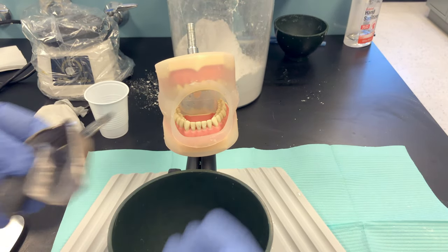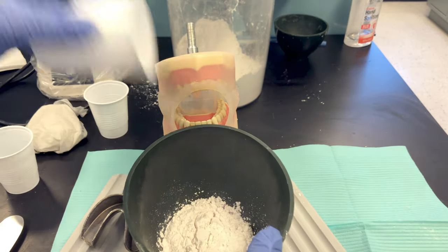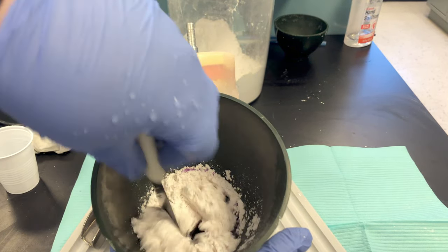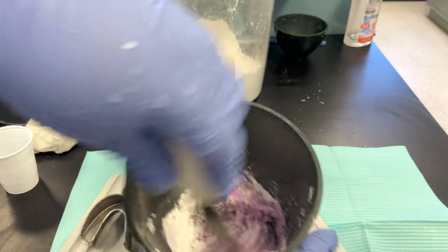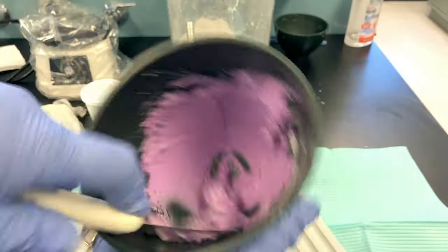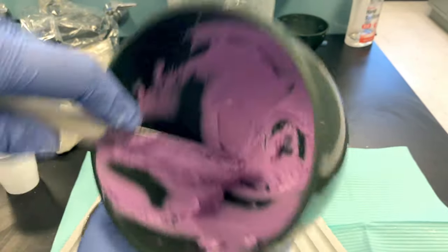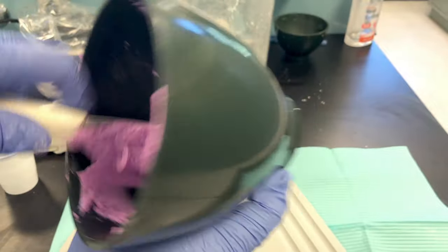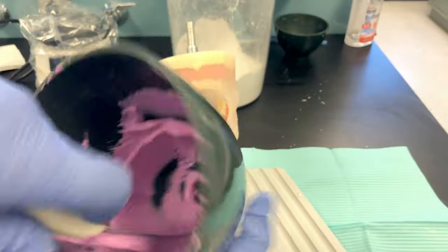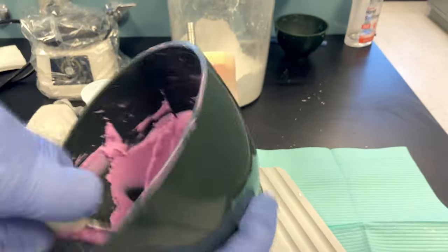Clean up your patient and give them a rinse and suction before moving to the next arch. For the mandibular, add powder to water the same way. Stir to incorporate, then spin the bowl and flex the spatula back and forth, pressing it firmly. Press it like you're squashing a bug — get a nice creamy mix with no leftover powder in the bowl.